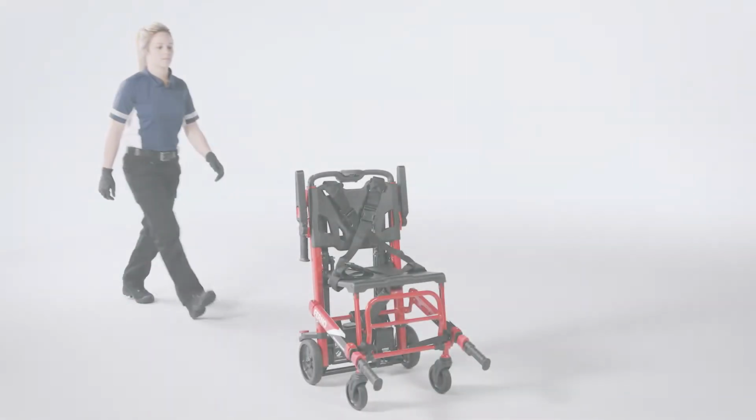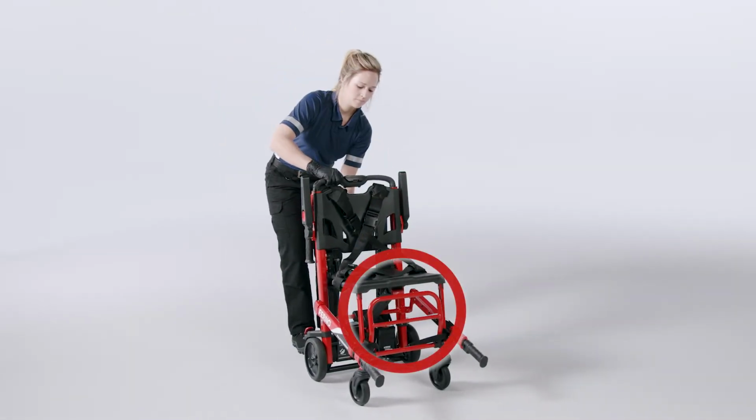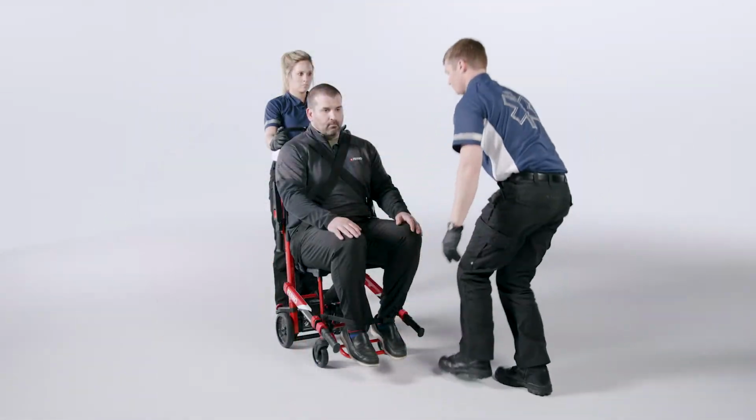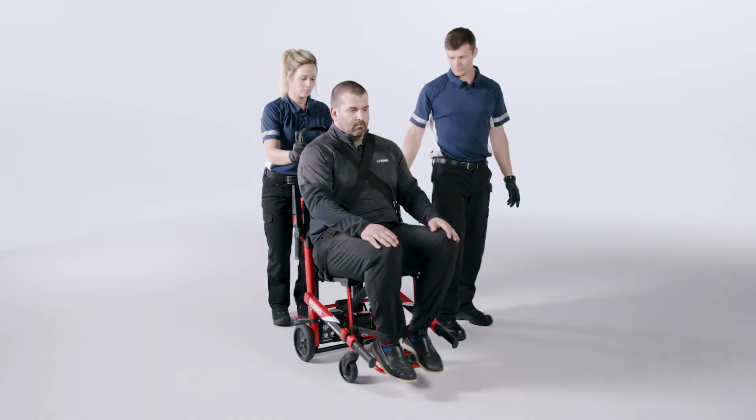When transferring a patient onto or off of the chair, engage the wheel locks and place the footrest in the storage position. Assist the patient using local protocols and fasten all restraints after transferring the patient onto the chair.